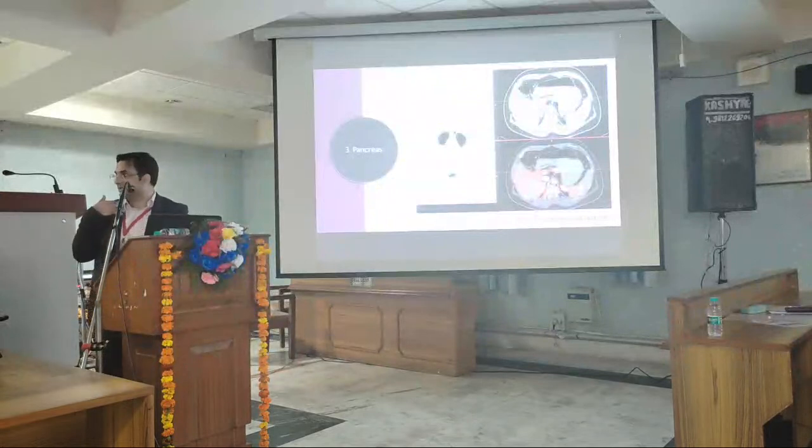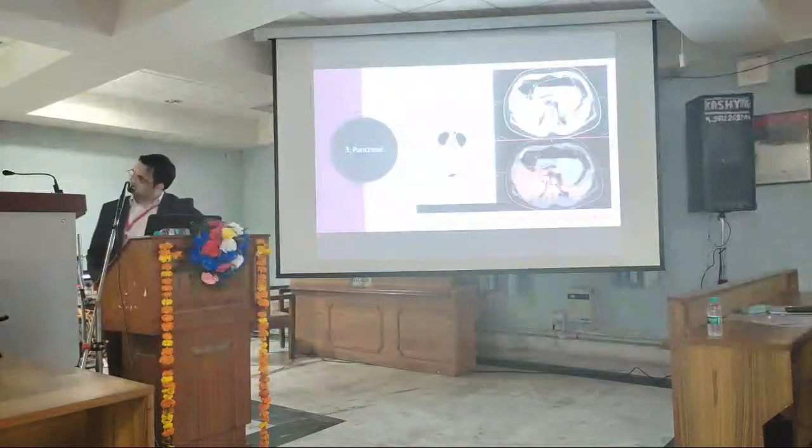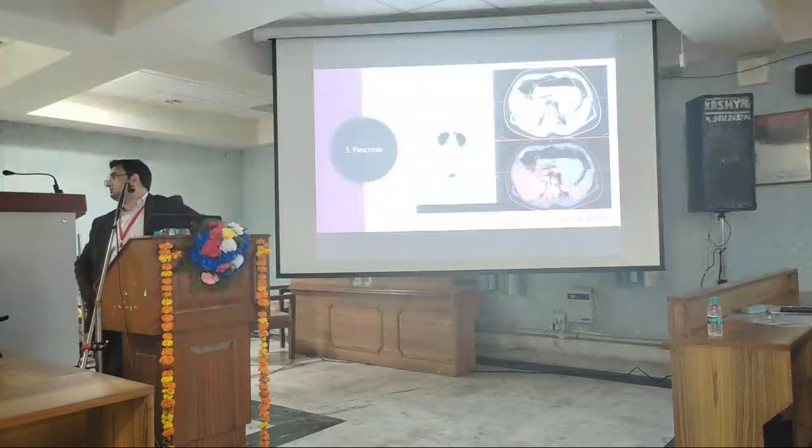Yeah. But if you're looking at the upfront, that's why I said a relook from another radiologist can probably sometimes avoid extra imaging. To answer Vivek sir's question from another perspective: as he has very rightly pointed out, this lesion is seen well on CT, so there is no reason why a radiologist would have missed it.